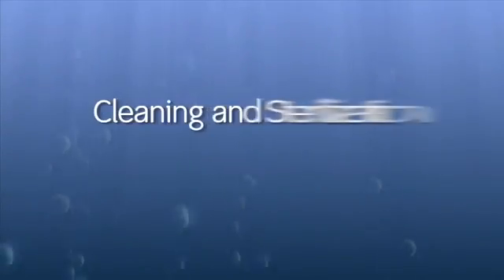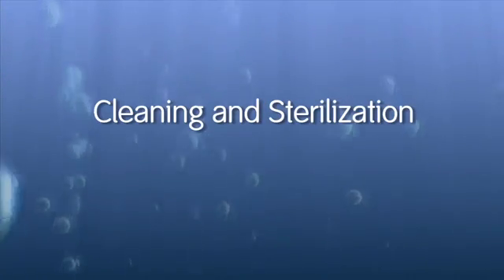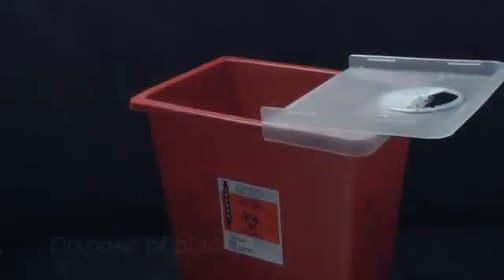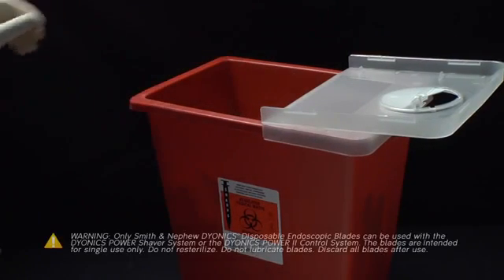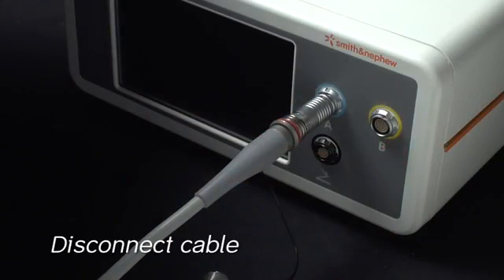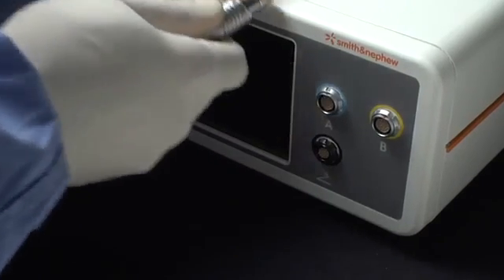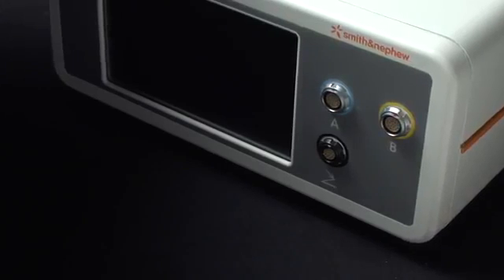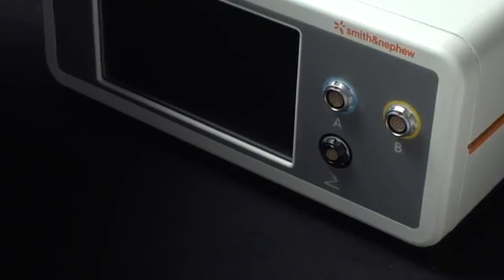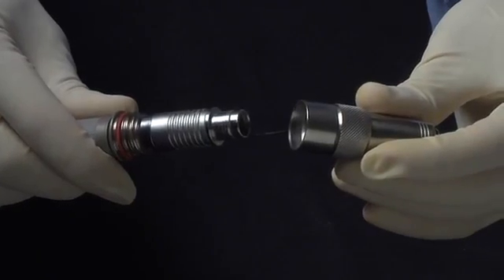Please note that these first two steps are done in the OR and are not performed by the sterilization department. Always dispose of any blade used during surgery following standard procedures for the disposal of biohazardous waste. Disconnect the handpiece cable from the front panel by pulling back the locking collar on the connector, then unplugging it from the control unit. Do not disconnect the cable from the handpiece.